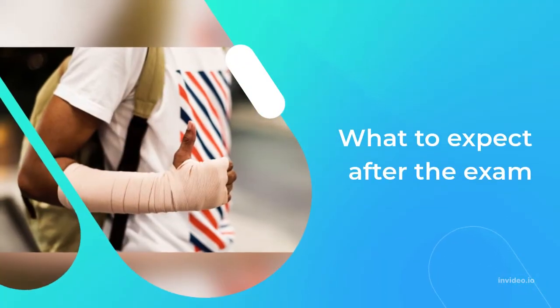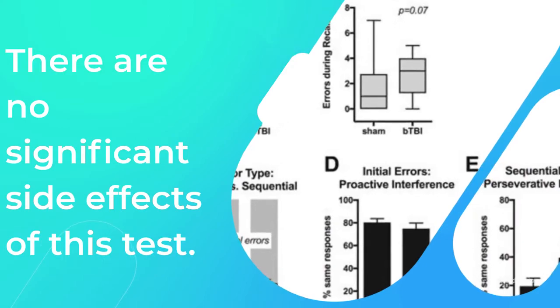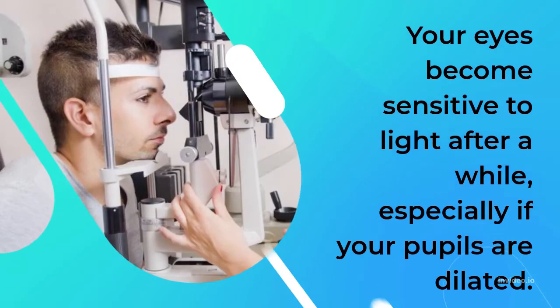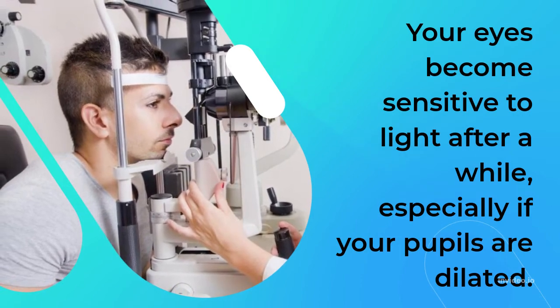There are no significant side effects of this test. Your eyes may become sensitive to light after a while, especially if your pupils are dilated.